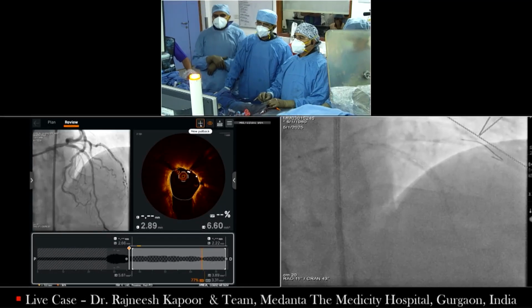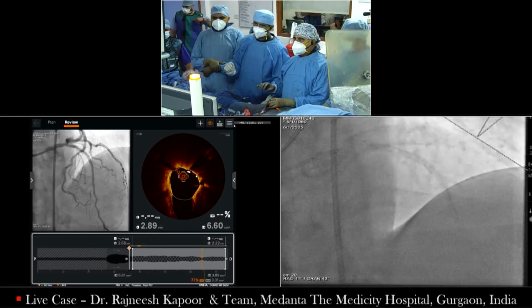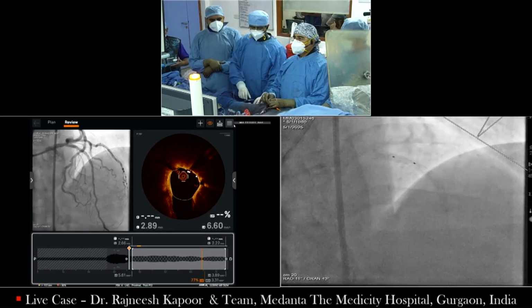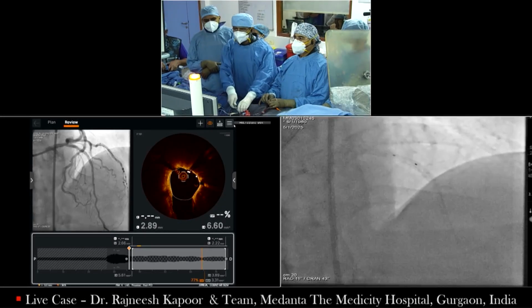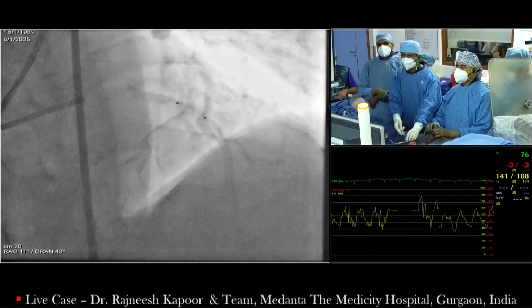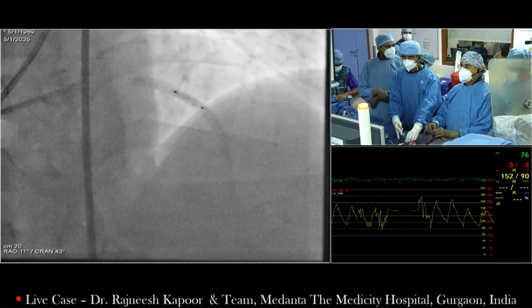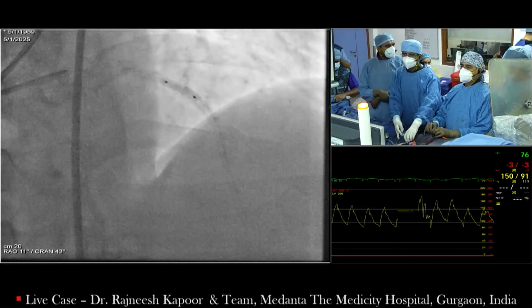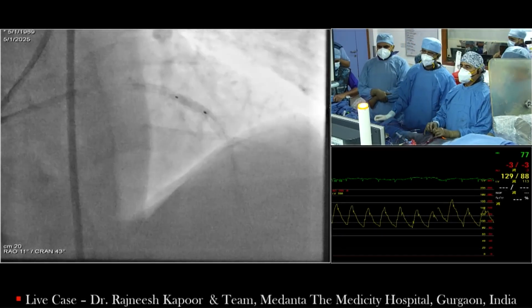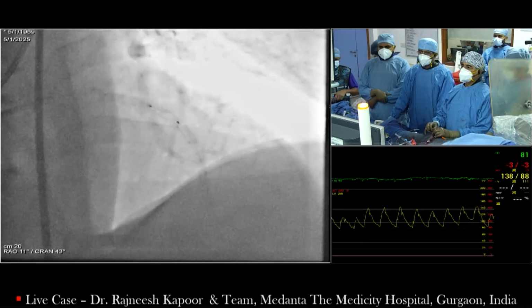So now we are on to the, I'm taking over, where it's intertwined. Okay, check. Okay, go up here. 6, 8, 10, 12, 14, 16. So Ramesh, 18 down. Ramesh, that balloon was from which company?